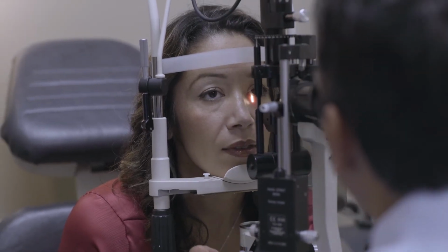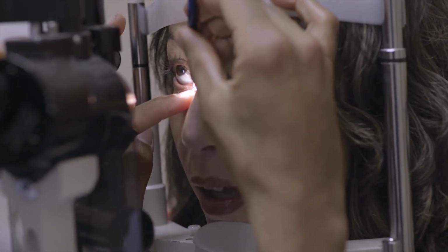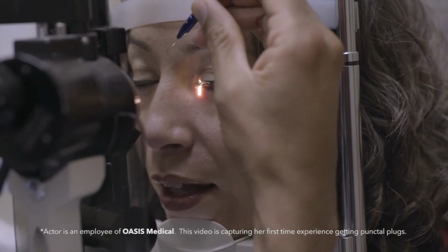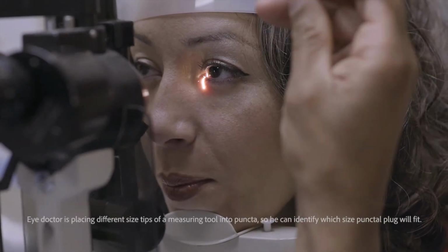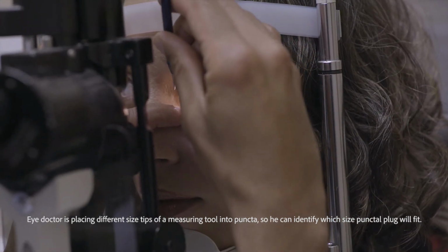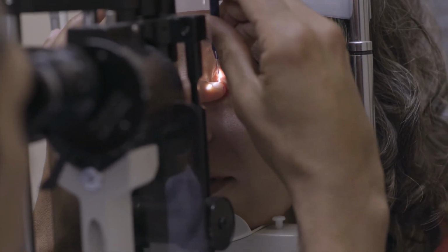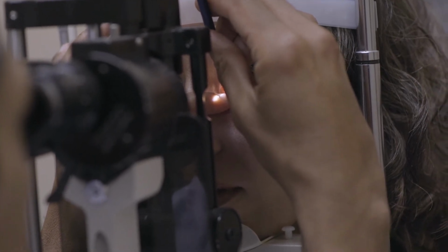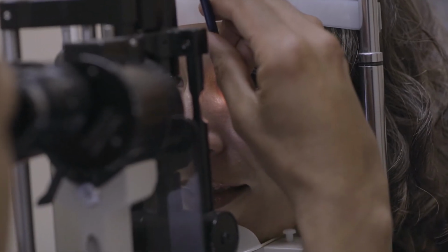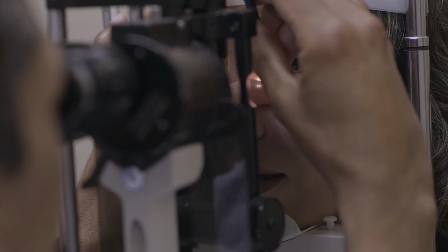And then we're going to have you just have your forehead hit that bar. So 0.5 is going to be snug. I'm not even going to try 0.6, you won't like that. Okay. And that's the right eye, right lower lid puncta. And then I'm going to do the left. You want to look up and to the left, sorry. It turns your eye away from the action. These are small punctas. It's a little uncomfortable, right? Yeah. What was that one? This is a 0.4. Oh. Yeah, it's a small puncta.